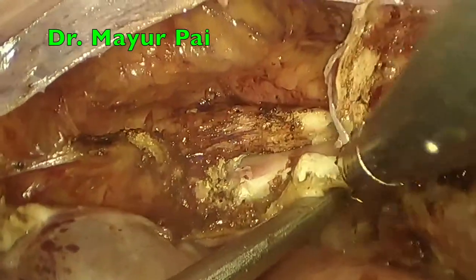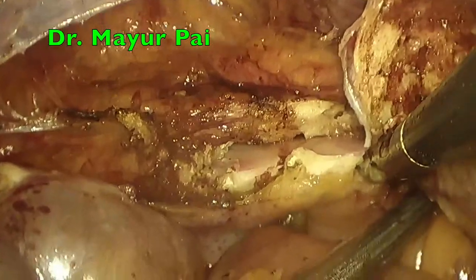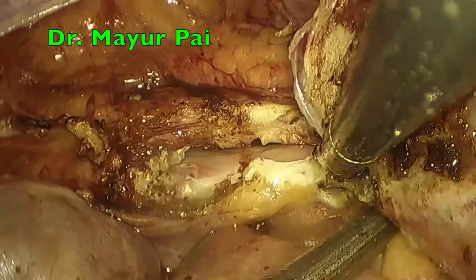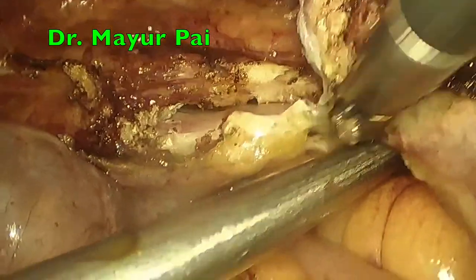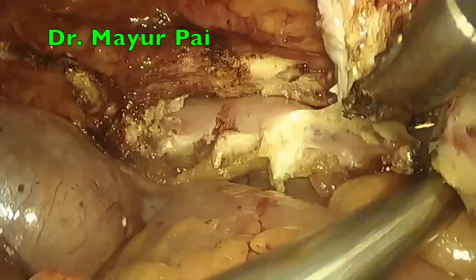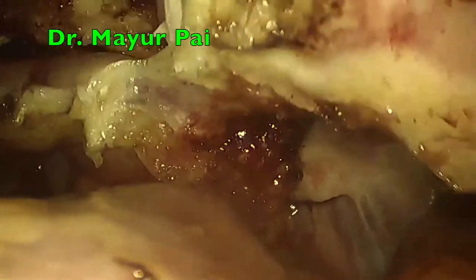You can very easily notice that there is no length of vagina that has been left on the uterine side and no length of the vagina is wasted and maximum length is preserved. This very fact is very difficult to achieve when we are doing an open hysterectomy.